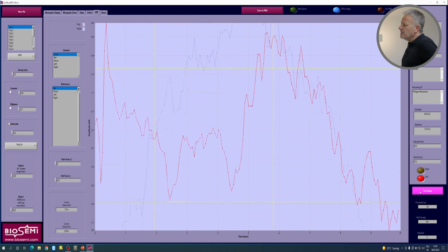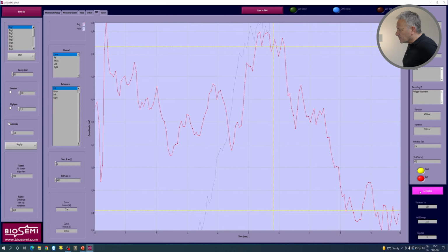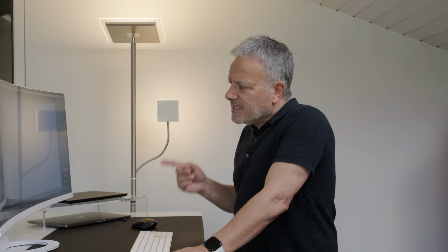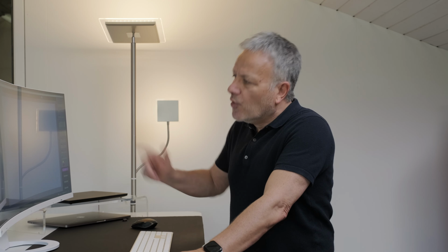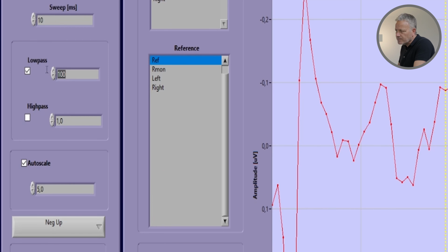Immediately we can see on the screen it's much more noisy, and that's okay. The latencies will be the same. Remember also that these electrodes have an open bandwidth, so DC to 3300 Hertz. That is why it's even more noisy than when we compare to what we've done before with the bipolar left channel. We have not set a bandwidth. As soon as we hit the bandwidth here, we go to 3000 Hertz over a high pass of 100 Hertz. You shouldn't go much higher because of the amplitude decrease.